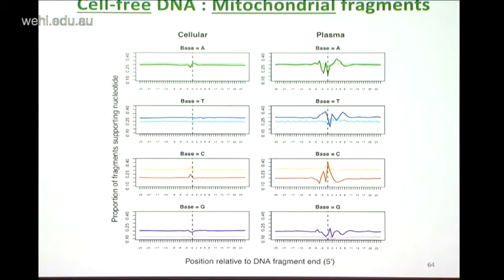So this is another feature where being associated with the histone changes what we see in the data. And this could also be related to how the two types of DNA are cleaved, or the biological process that gives rise to these cell-free DNA fragments.